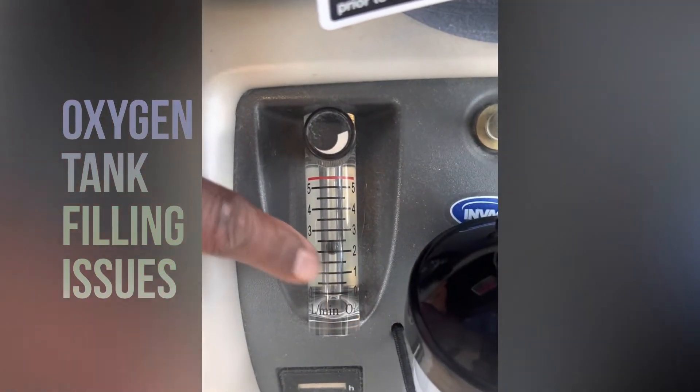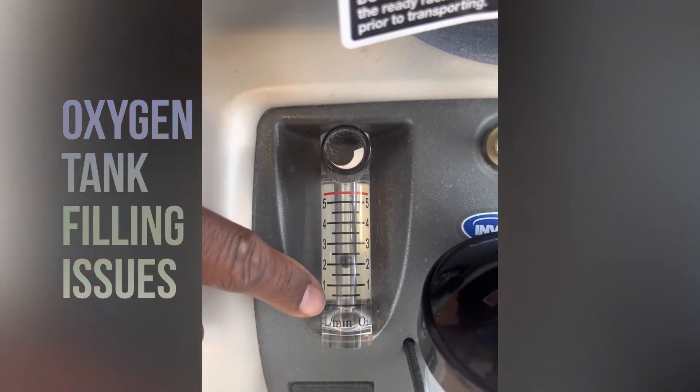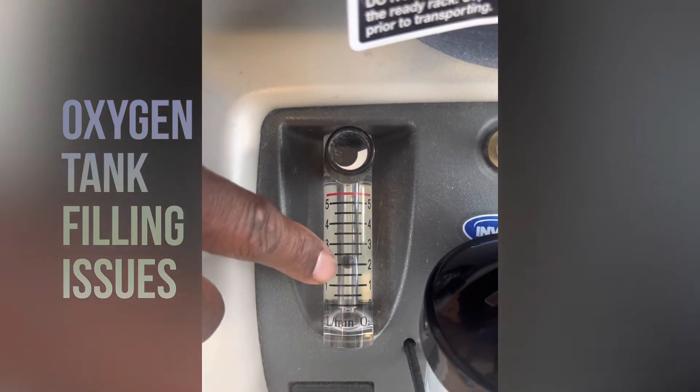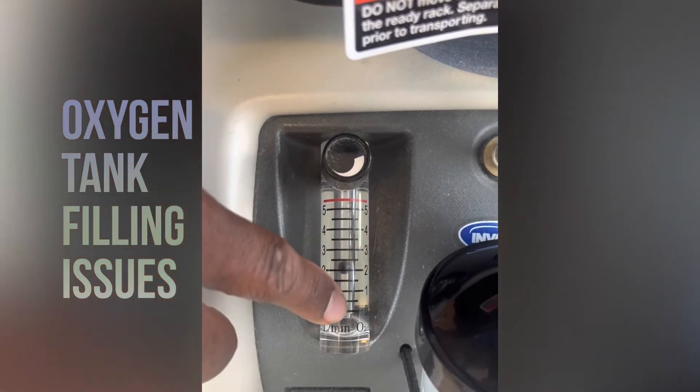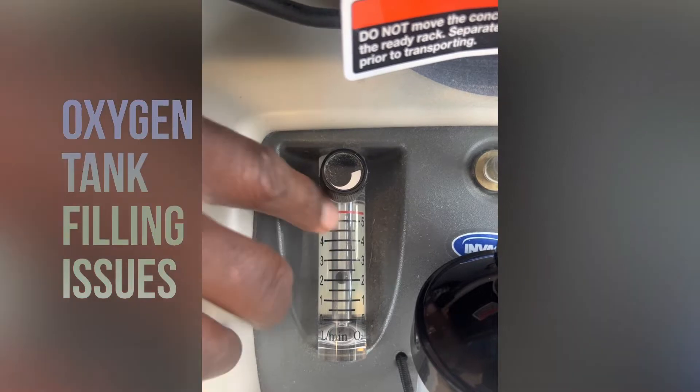Is it on two, below two, or above two? If it's above two, we have to bring it down because you're not going to be able to fill your tanks if it's over two. If it's under two, it's fine and we'll move on to the next step. Let's say it's under two and it's in the right spot.